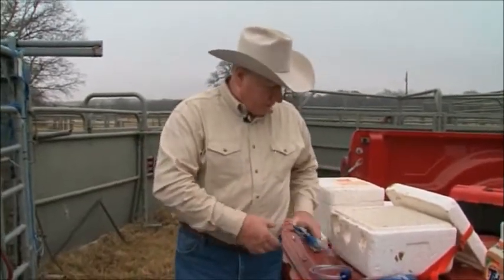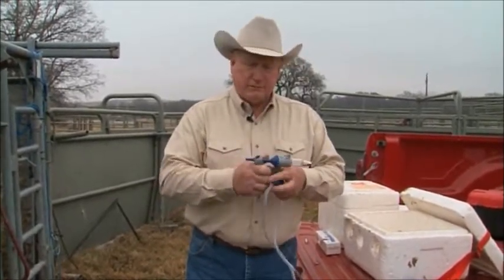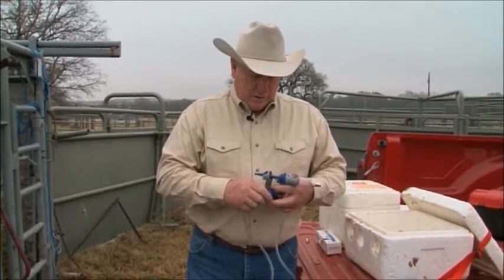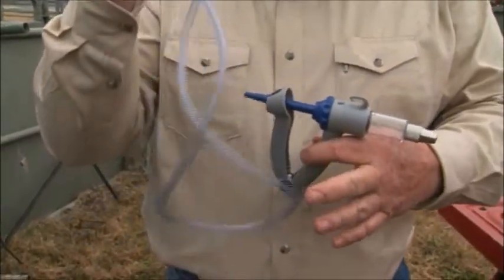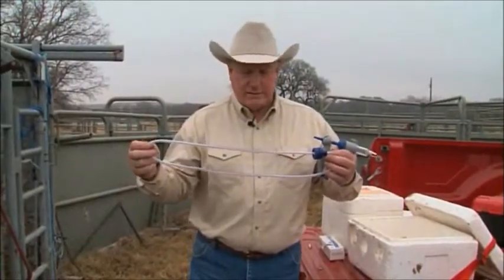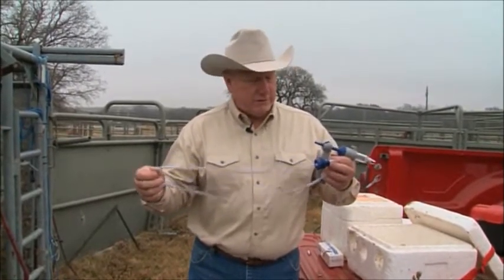Another one on a similar concept are these that have hoses. This is a preferred method for a lot of people, where the hose attaches directly to the syringe and then the other end to the bottle. The problem with that is the hose. That hose can expose vaccine to sunlight and expose it to more of the elements, particularly if it's cold. I would not use one of these if it's below freezing.